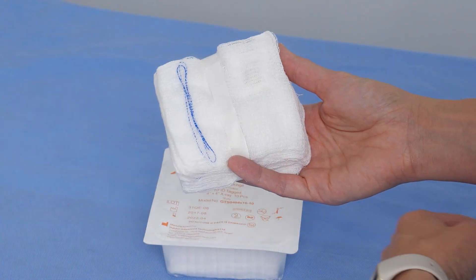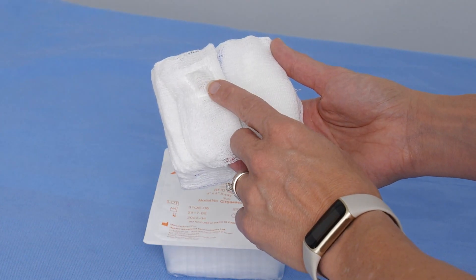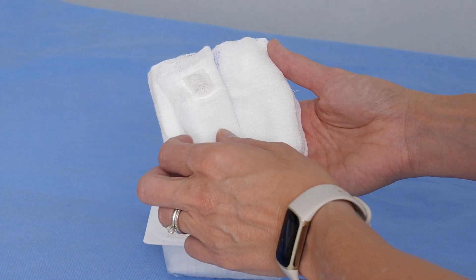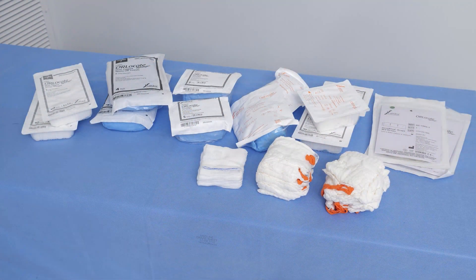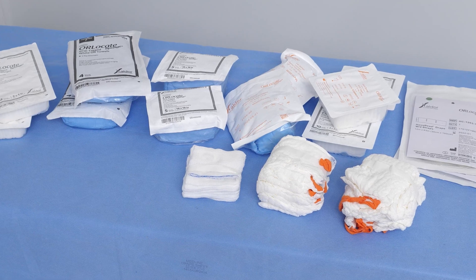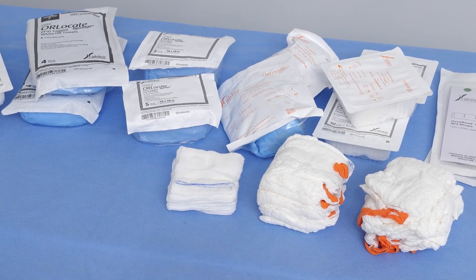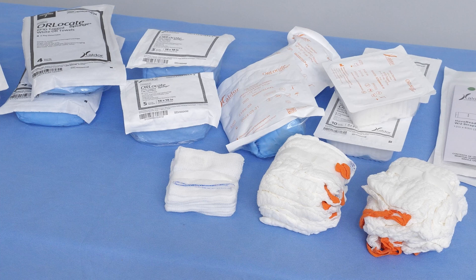The surgical sponges have a unique RFID chip sewn into each sponge or surgical towel. Only Steris-supplied RFID sponges and towels can be used with the OR Locate system. Steris provides these in various sizes and plies to support procedural requirements. They are available as single sterile packs or as surgical packs, which provide a variety of sponges and towels to support specific procedures.